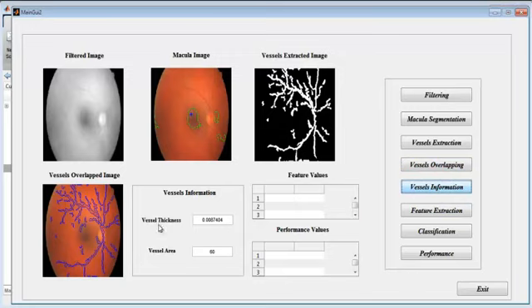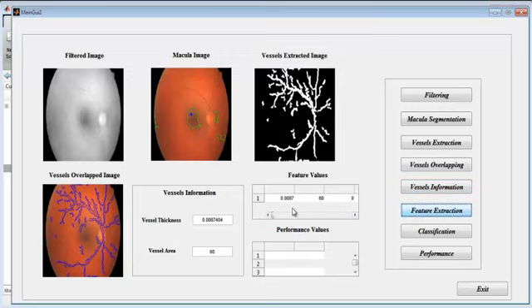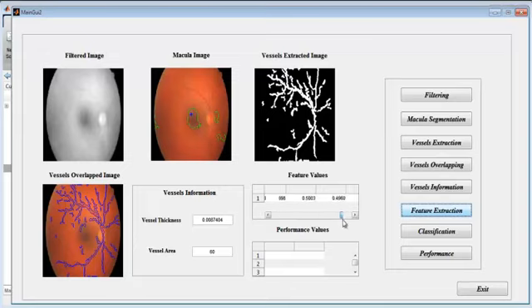From vessel information, we get information like vessel thickness and area. For feature extraction, the features — thickness, area, and centroid — which are the local features, are all present and displayed.